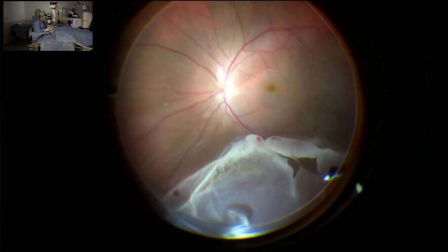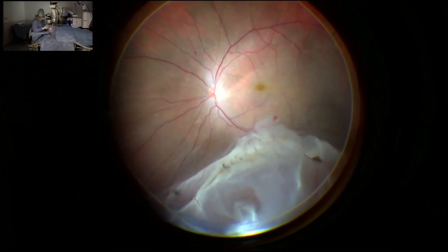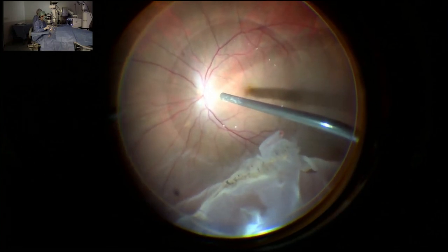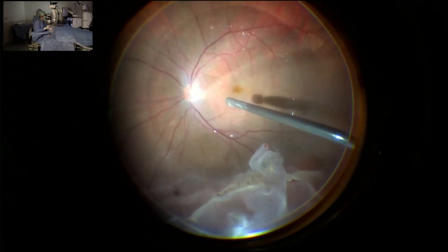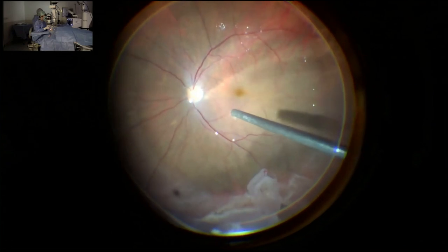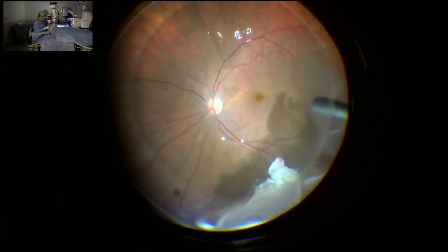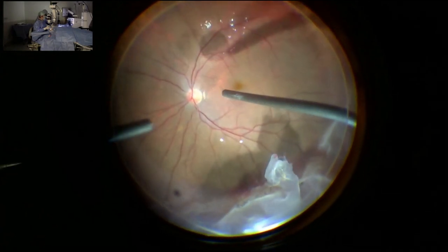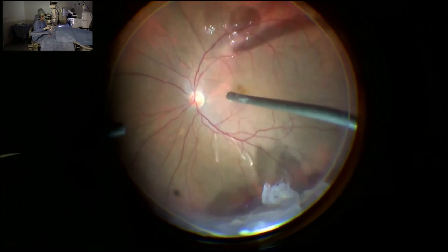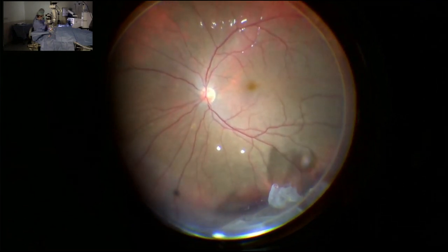Okay, so we have finished the core vitrectomy. Now I will inject PFO, perfluorocarbon. I prefer to keep the posterior pole stable during vitrectomy. And usually I inject PFO until the edge of the retinal tear to stabilize the posterior pole. Back pressure. Yeah, it's okay now. The tear is a very, very large tear. It's not a giant tear, but it's an irregular retinal tear. So the posterior pole retina is attached.